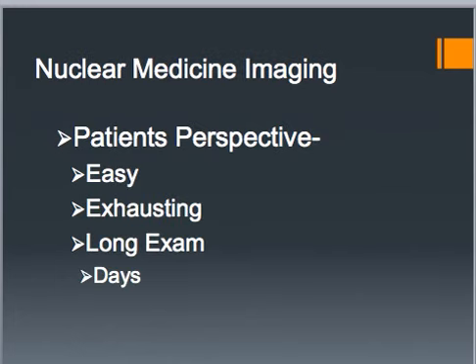The patient's perspective is going to depend on the individual, right, and what exam they're having done. They can range from very easy to being exhausting. Sometimes they need multiple scans on multiple days, so they can be long exams or the days can feel long. And like I said, it's going to depend on the patient.